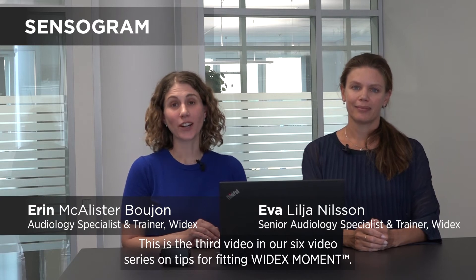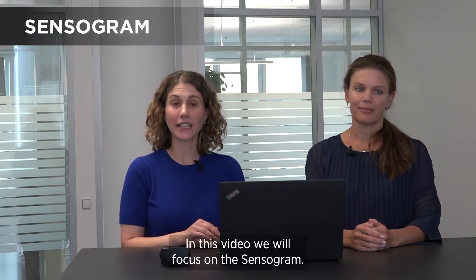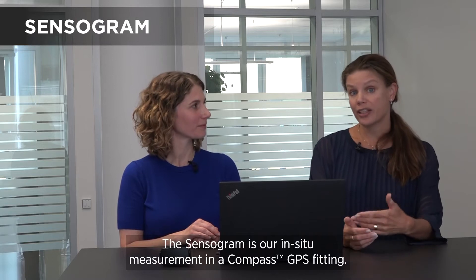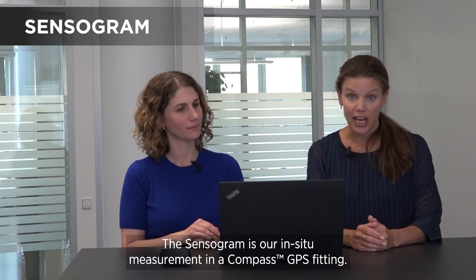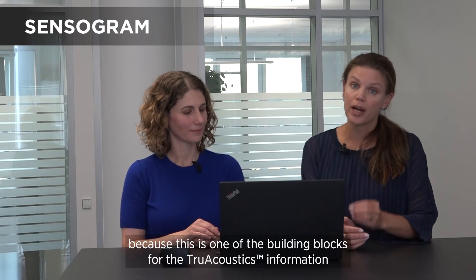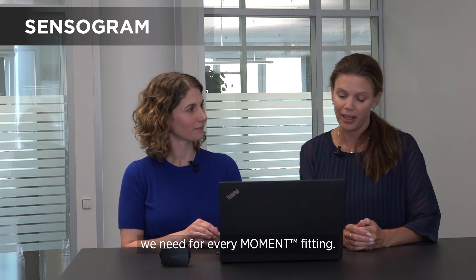This is the third video in our six video series on tips for fitting Widex Moment, and in this video we will focus on the sensorgram. The sensorgram is our in-situ measurement in the Compass GPS fitting section. In Moment hearing aids it's even more important to do the sensorgram because this is one of the building blocks for the true acoustic information that we need for every Moment fitting.